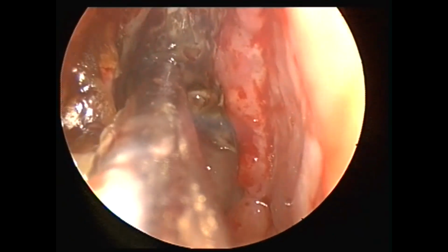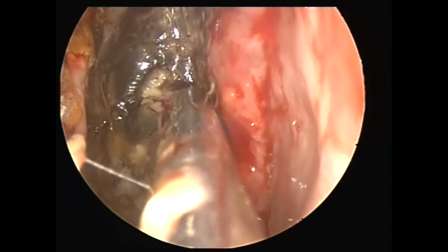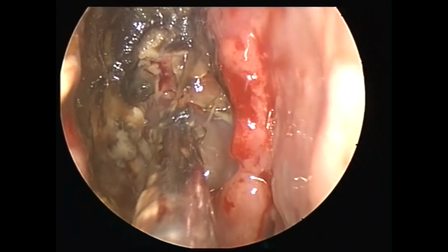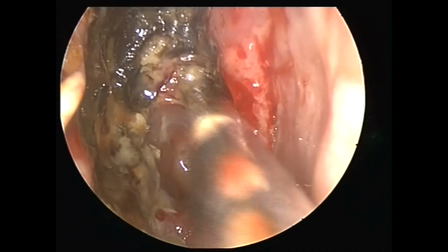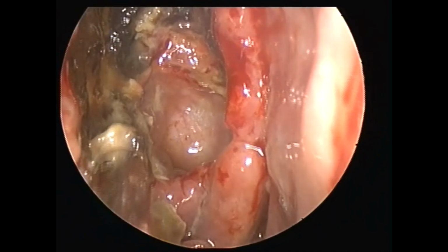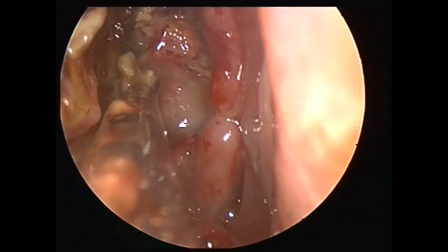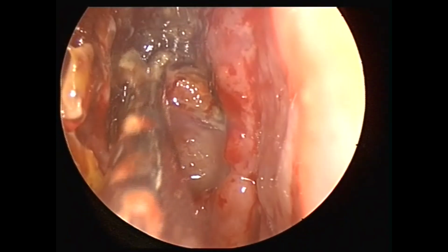Now this is the 0-degree endoscope, and what I'm trying to show you is the skull base area. Whatever scab you can see, that's the sphenoid sinus in which the suction was there right now. And I'm trying to remove the scab right now above the sphenoid sinus. That's the roof of the maxilla, and that's the lamina papyracea right now. I'm trying to remove the scab on it.